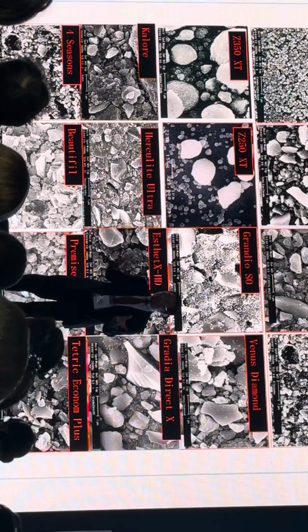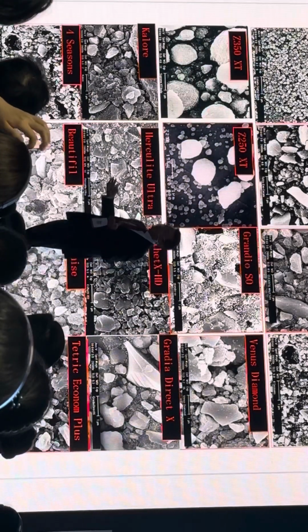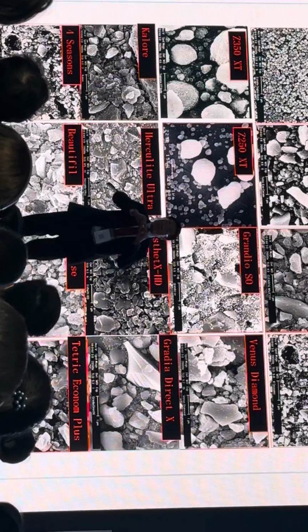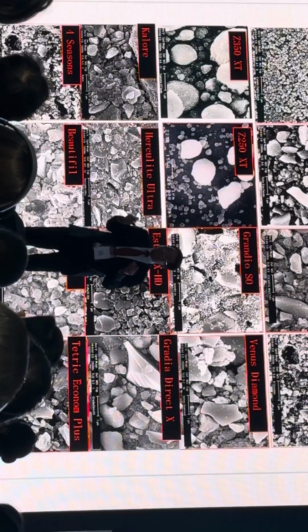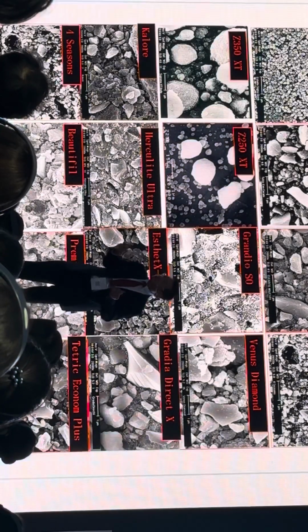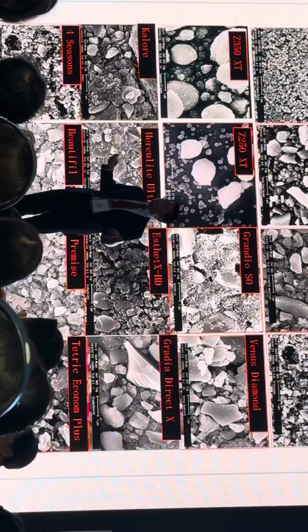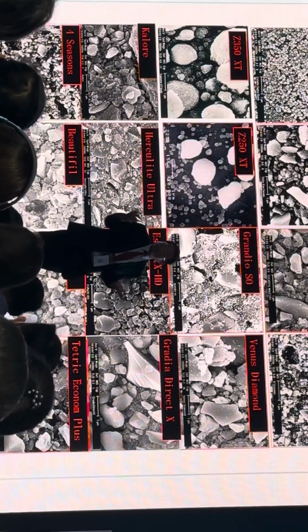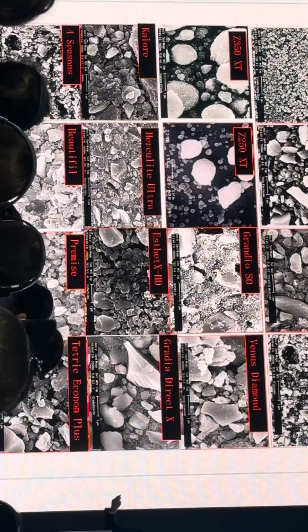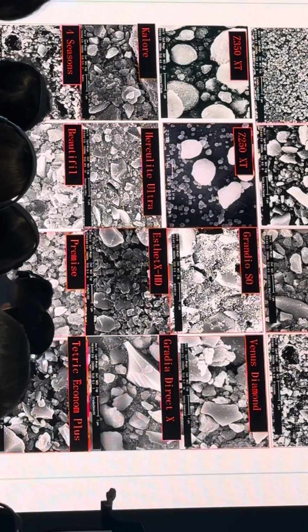So composite is a kind of ceramic family. Okay? Not all clinical cases need ceramic. Ceramic is 100% silica zirconia, that's why it's very hard. But composite resin also contains silica zirconia, and the percentage is lower. So this kind of product we call composite resin. So having good composite is enough. If you make a ceramic, you need to grind a lot of healthy structure. But with composite, you don't need to.